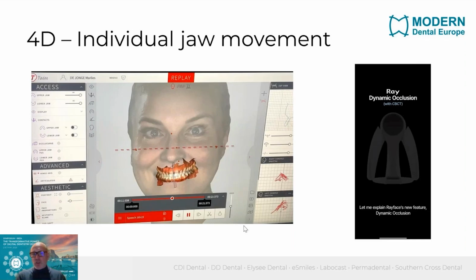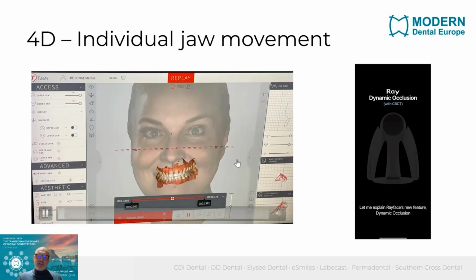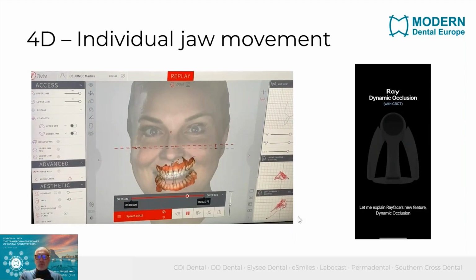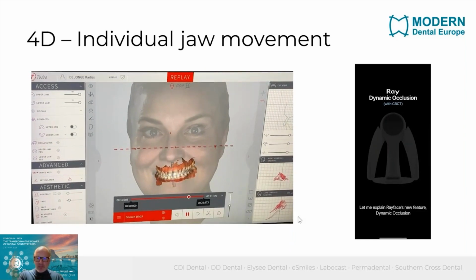For instance, the Mojo is a very known device, and this Mojo is actually an advanced digital tool which really captures the jaw movement using 4D technology. So it enables really precise tracking of the mandibular movements, and this makes, of course, the diagnostics better, the treatment plan individual, and more precise and better overall.